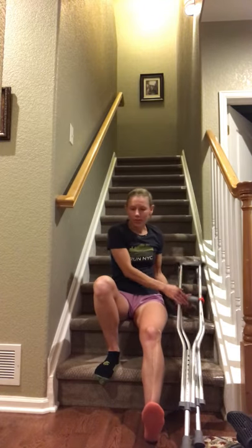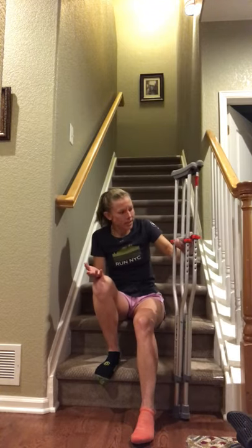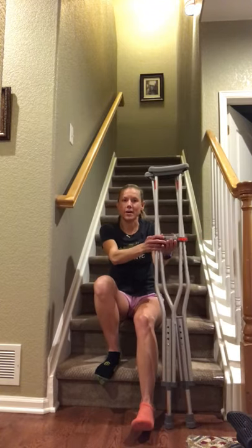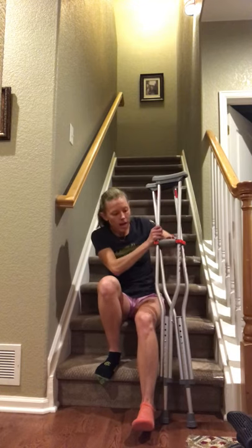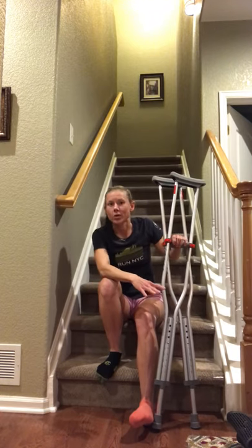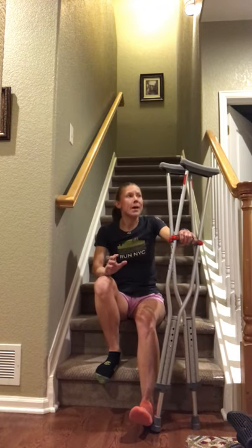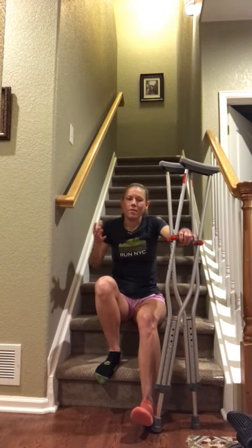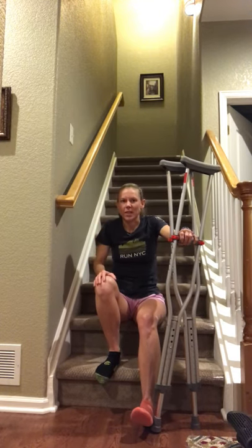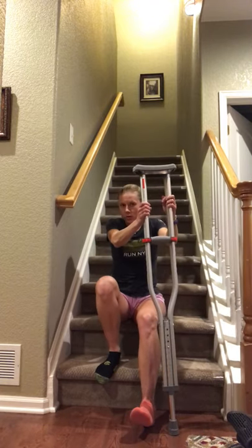I've actually got a couple different crutches to show you. I have my axillary or underarm crutches — these are pretty standard here in the United States and are often given at the hospital. I also have Moby Lake crutches, which are really popular with many patients with hip dysplasia, and I have my Lofstrand or forearm crutches. The technique for going up and down the stairs is absolutely the same no matter what crutches you use. I'm going to start off by showing you with the axillary crutches.